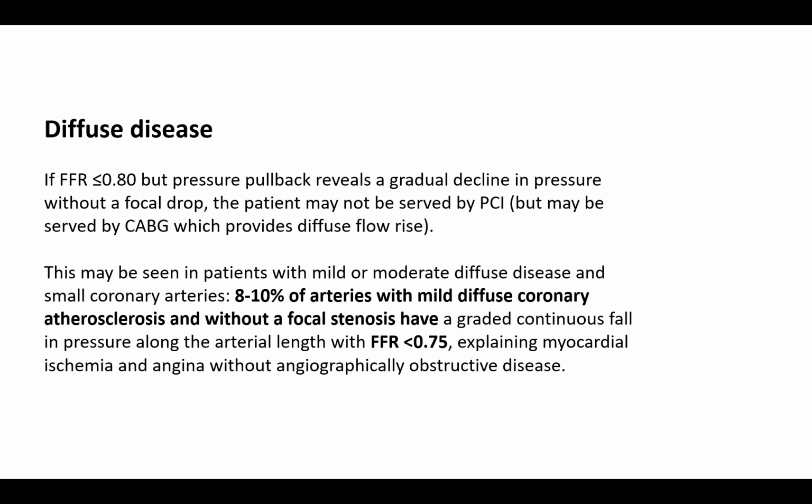You'll have to stent the whole vessel. There is no focal drop. There is no focal area with a dramatic rise in IFR or FFR on pullback. However, this patient may be served by CABG, which provides diffuse forcing of flow throughout the whole vessel.